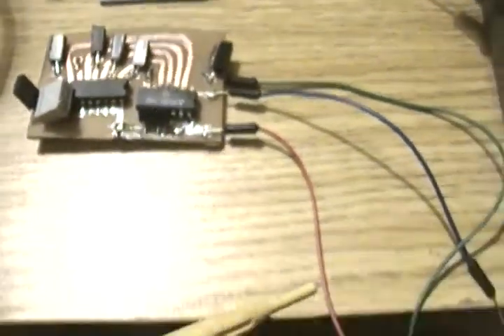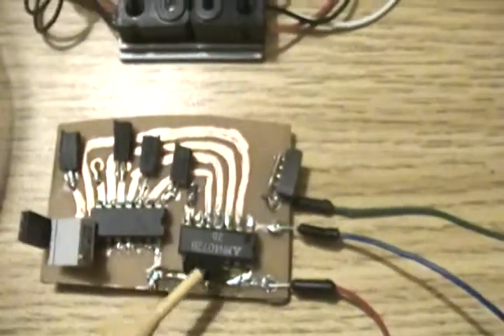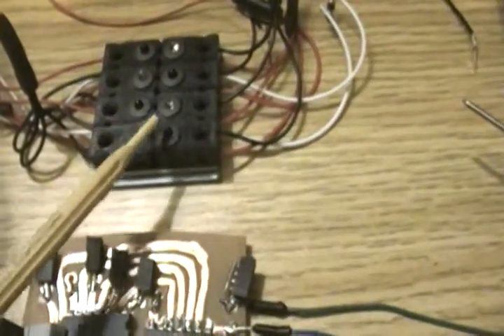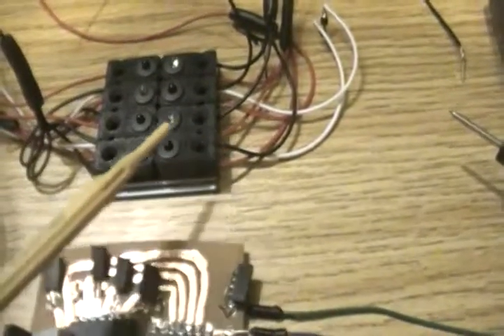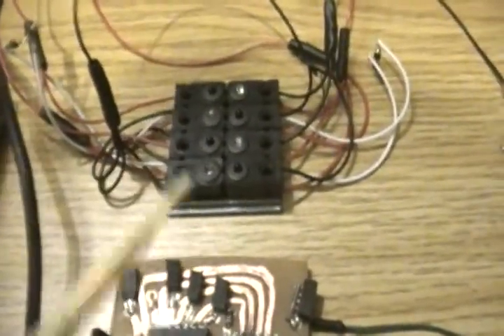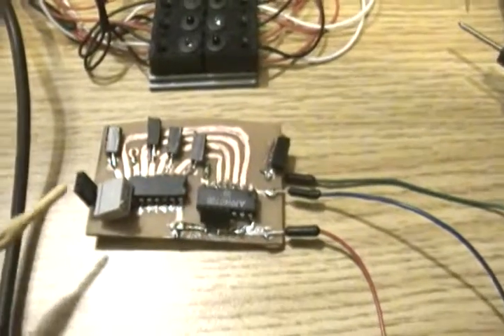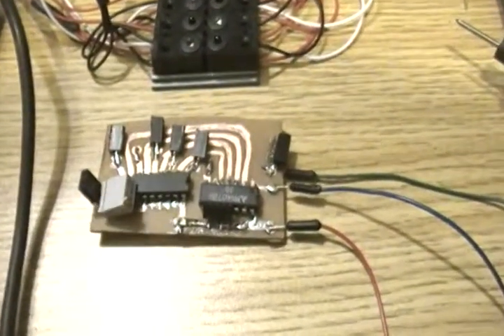Now this is the plus in that goes voltage in 5 volts, and it's connected to a 4 holes input here, and you're gonna use only 2 of them, and you're gonna plug in here the detectors. The detectors are the dark ones. So 1, 2, 3, 4, they're paired by 2, so you have 2 red wires here that go from this one and this one, plugged into one single wire. Same thing here, the 2 wires, this and this, red, they go into another red wire. So you have one wire from here, one wire from there, and you plug them in here. So all these red wires, 2 of them, you plug them here from the detectors, 2 of them you plug them here from the LEDs, and you adjust the intensity of the LEDs using this potentiometer.